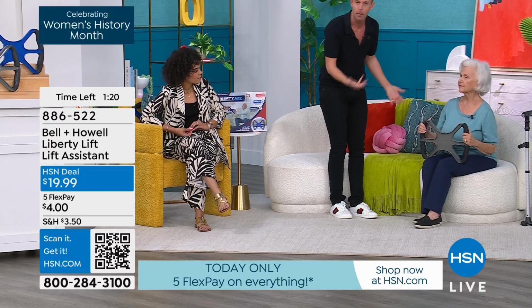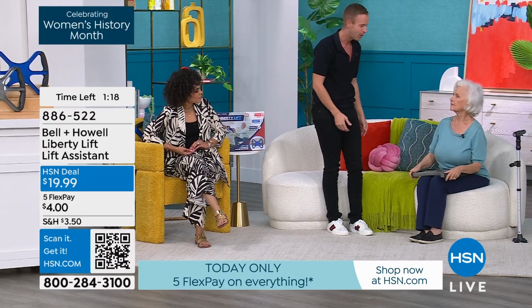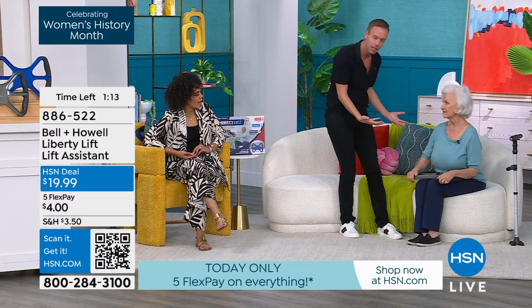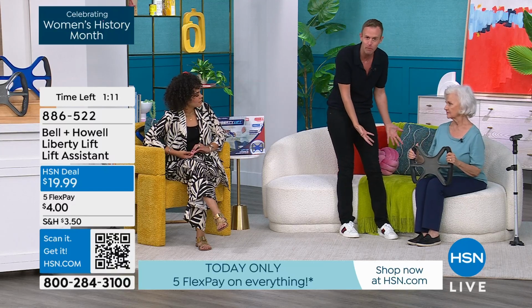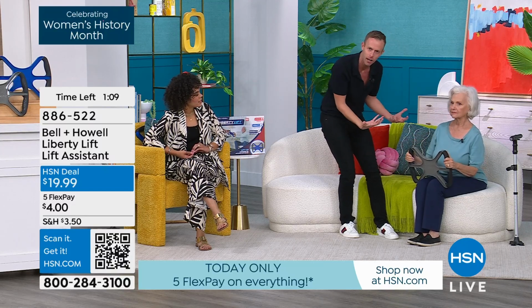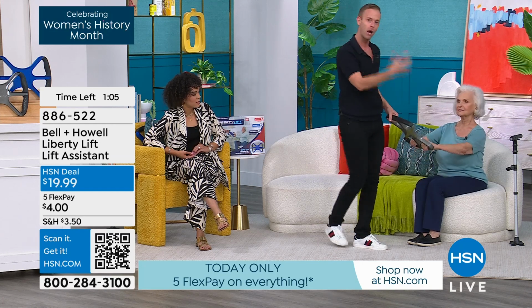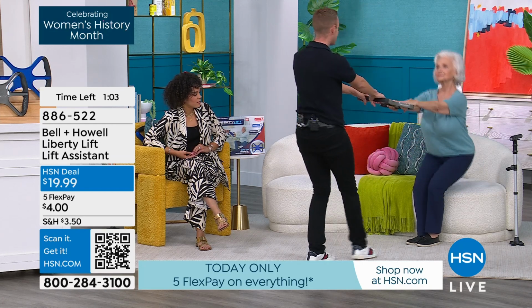I'm going to get up for a second, because if Patsy were my mom or my grandma and I went over to help her, or my girlfriend, then I would have to go like this and help Patsy up. And if she's my mom or my grandma, I don't want to be grabbing her behind to help her up. This is the assistant: okay, Patsy, you need help getting up? No problem. Here we go. 3, 2, 1. And she's up.